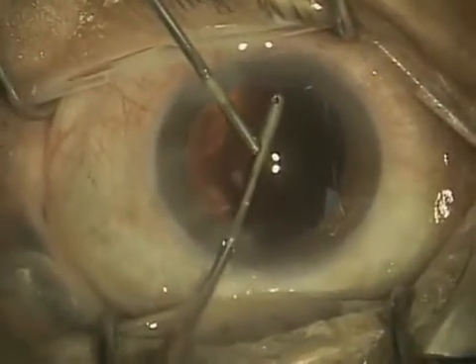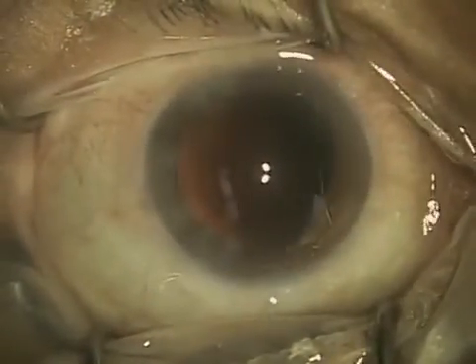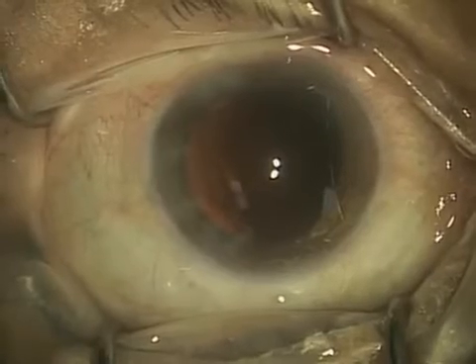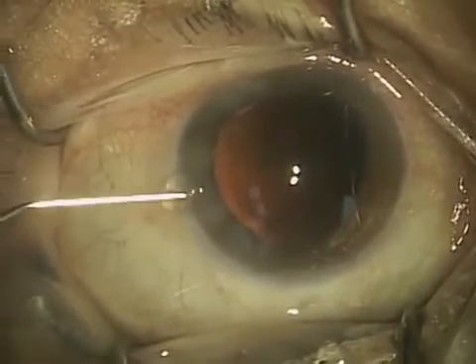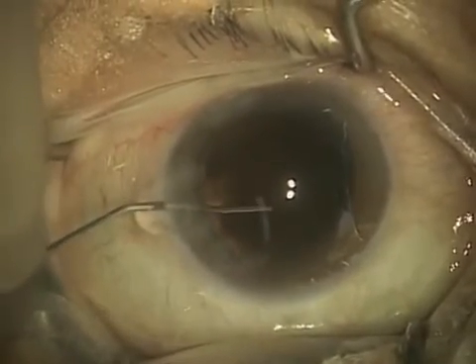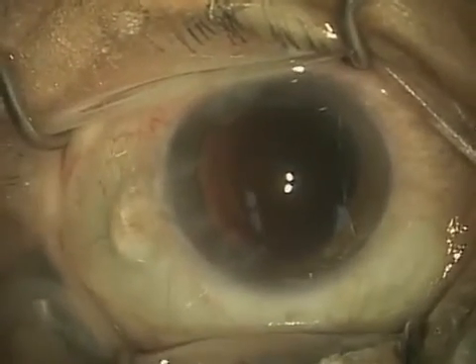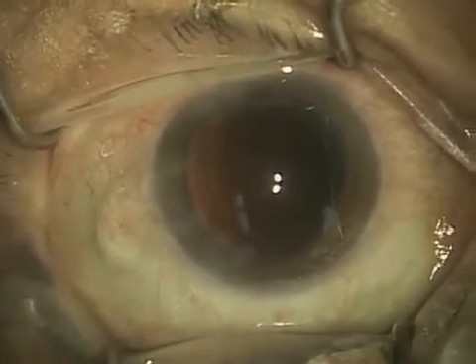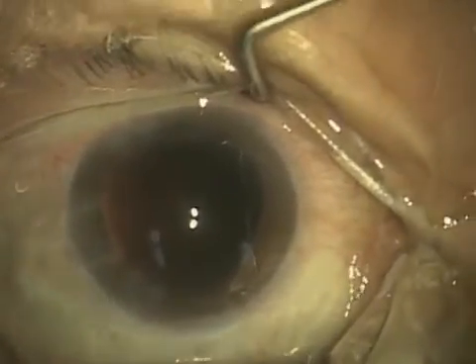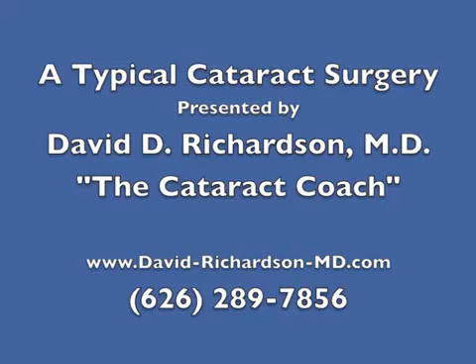The next step you'll see: I will actually place some viscoelastic into the capsular bag, and that frees up space that I will then use to insert the lens. Here's the viscoelastic — it's transparent so you can't really see clearly what's going on, but I've just filled up the eye with a viscoelastic gel, and this is going to let me place the lens in safely, which I will show you in the next and final segment of a typical cataract surgery.